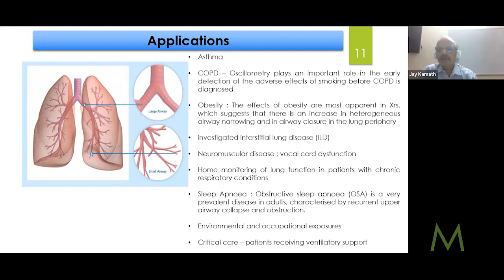So what we have done, at least in the Indian context, first of all, any obstructive lung related issues are not at all getting diagnosed here. That's where we are. From there we have come a long way, asking them to breathe into something like this, because the moment they see a spirometer, they run away. Is that a large percentage? Do we have any statistics on that? Around the 30 to 35% mark. Ooh, that's a lot. And that's just India. We are right now only in India.